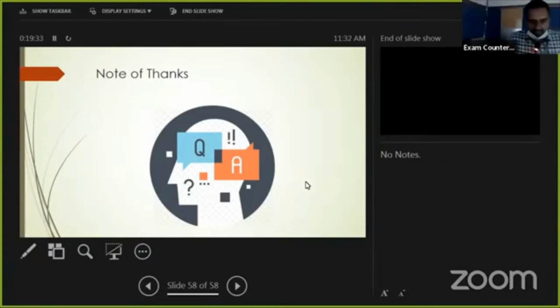Yes, sir. We have basically employed some rules there. Typically, no companion stays with the patient after the radioactive medicine is injected, but we enforce this strictly as well. We have put up warning signs, including warnings for the companions. Although the readings are not that high, there is still a chance of some radiation-induced effects, so we have taken it into account.